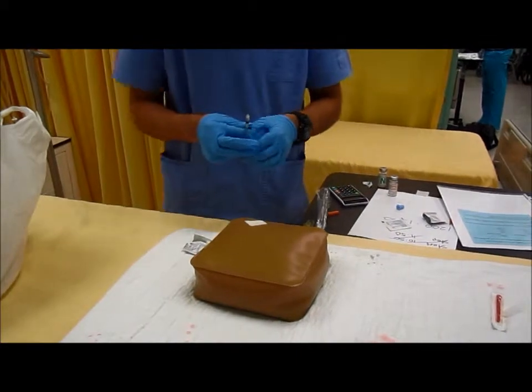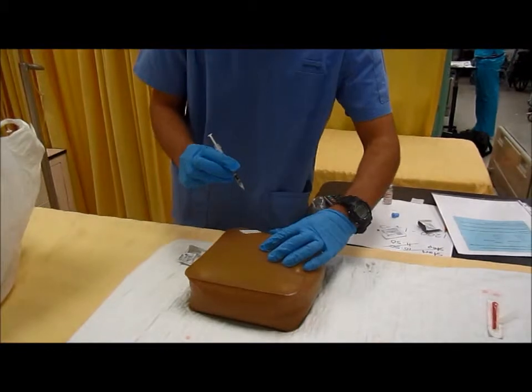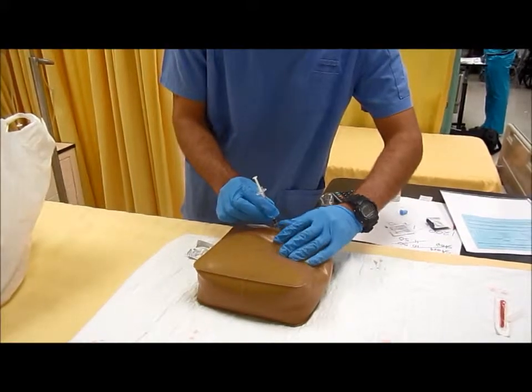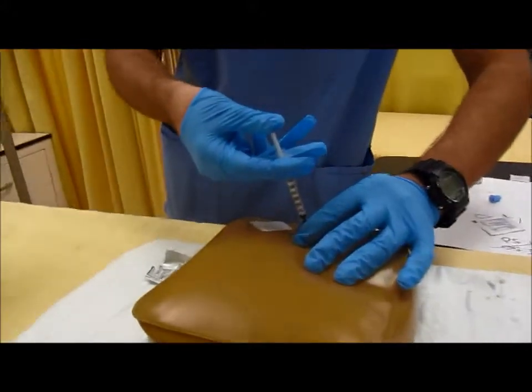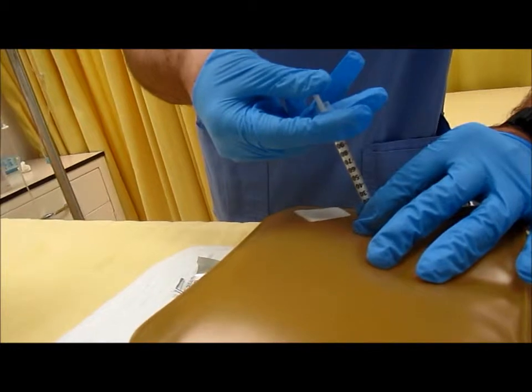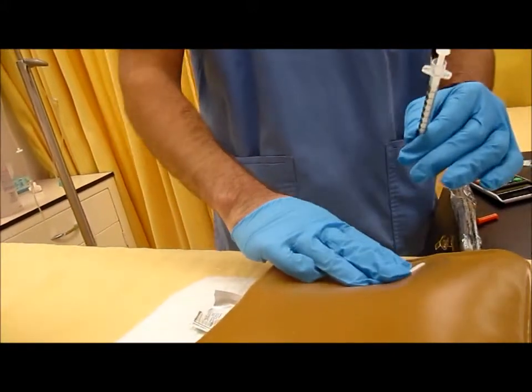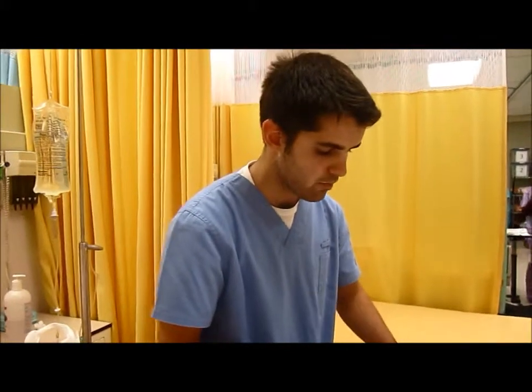I would dislodge the cap. For subcutaneous, it's pinched at a 45-degree angle. So I'd pinch it. I would inject it, stabilize, and inject at 10 seconds per 1 milliliter. So I'll just go at a good rate. Pull up, put pressure on it for about 10 seconds, and I would dislodge this needle. Throw this needle out without decapping it.